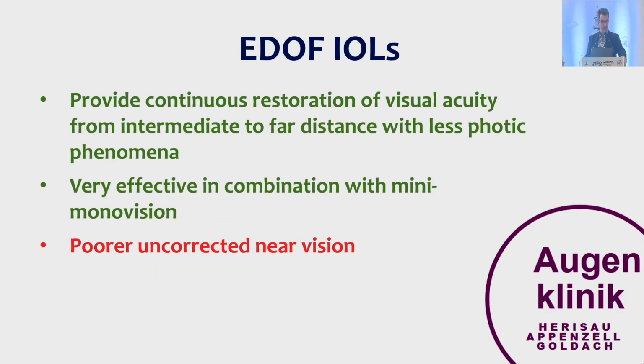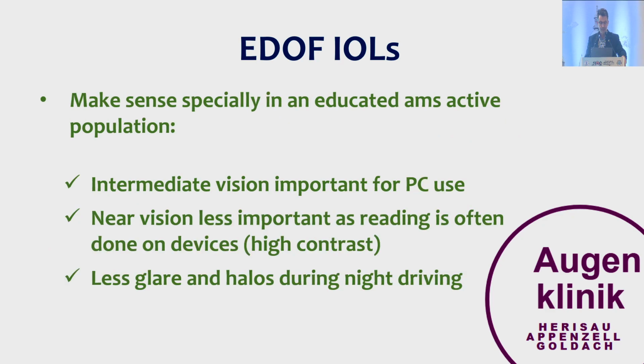EDOF IOLs provide continuous restoration of visual acuity from intermediate to far with less photic phenomena, and they are very effective in combination with a minimal monovision. Of course, the uncorrected near vision will not reach the level of a trifocal IOL.